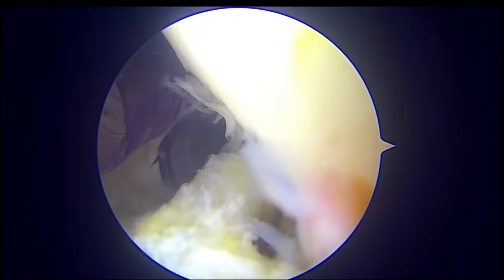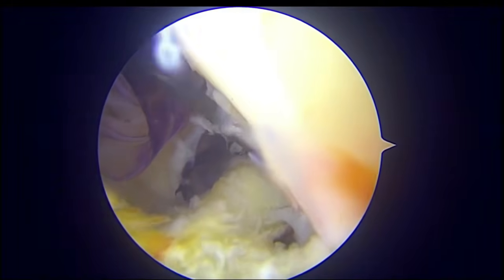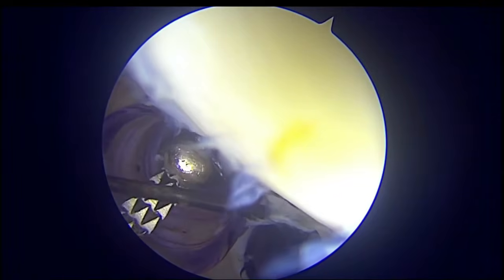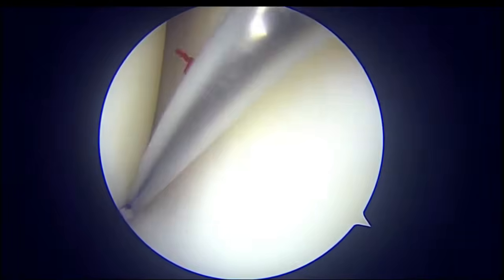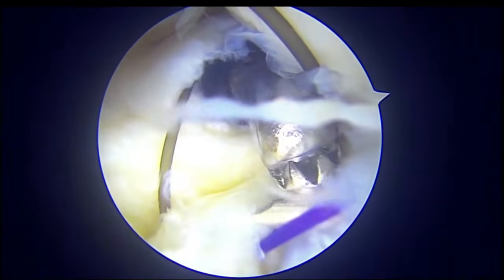So with the lasso, I was able to put the suture in one limb of the tear. But as this tear was more inside, I could not pass the lasso through the other limb of the meniscus, as I was afraid of damaging the cartilage. So I pushed in a needle with a Prolene suture through the anteromedial portal. This is a cannula, that is a 16 gauge cannula. You can see the Prolene suture inside. And from the anterior, I pushed it through the meniscus.